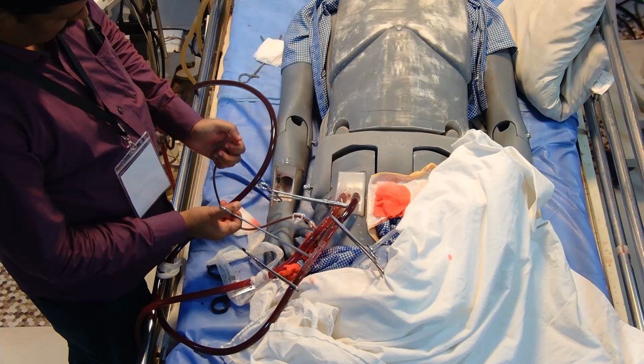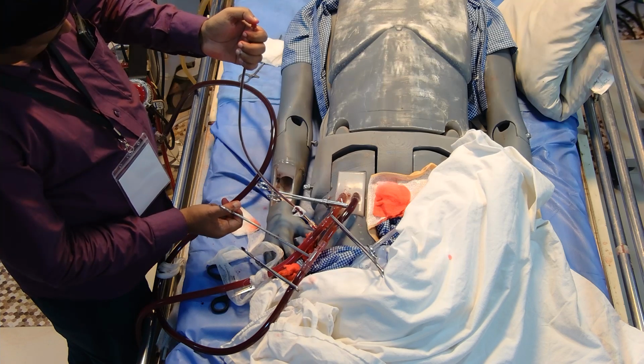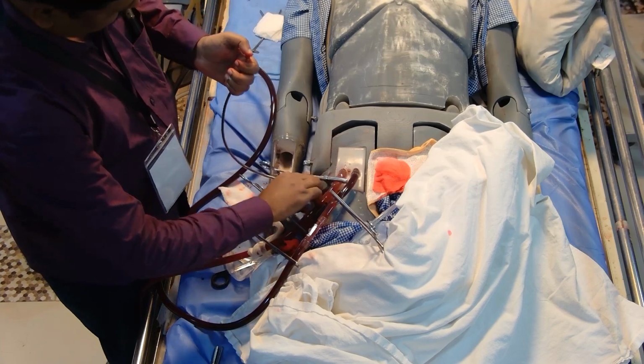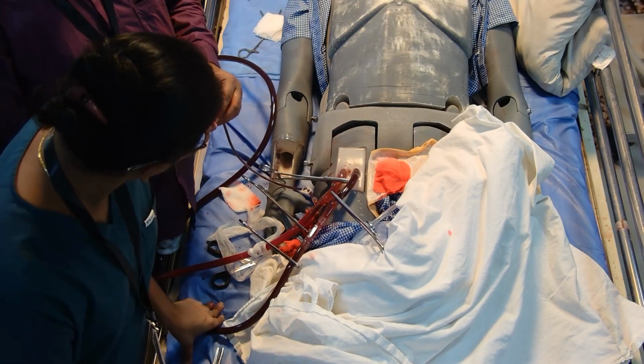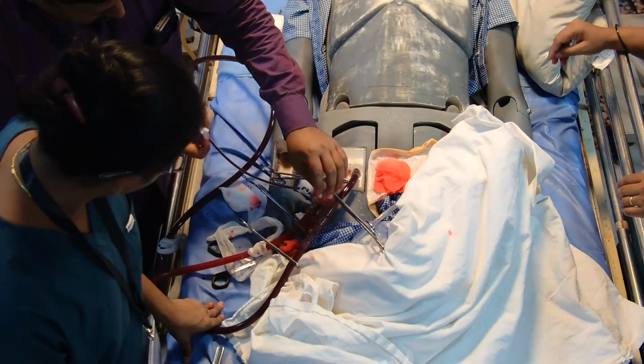You have to de-air the bridge also before you connect. You can use a 3-way also for connecting this bridge.